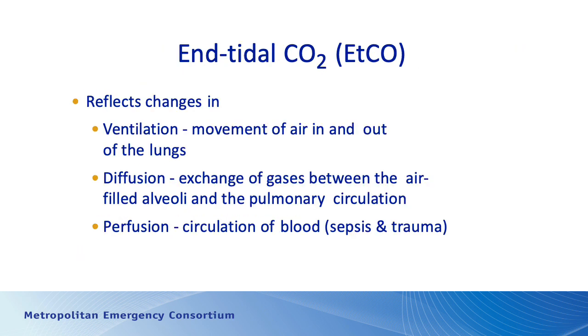End-tidal CO2 really reflects changes in ventilation, so we can look at the CO2 values and get an idea of how well air is moving in and out. We can also get some idea of how well it's diffusing across the membranes in the alveoli and pulmonary circulation. And we can get some idea of perfusion, in terms of how well blood is circulating and going to the alveoli for air exchange and carbon dioxide exchange. We can use that for sepsis, trauma, and any of the other low flow states.